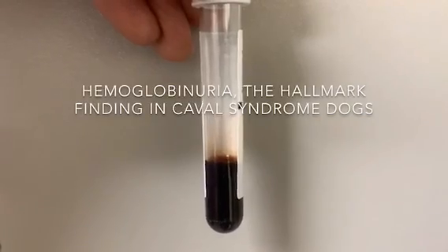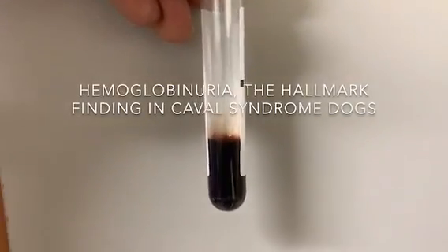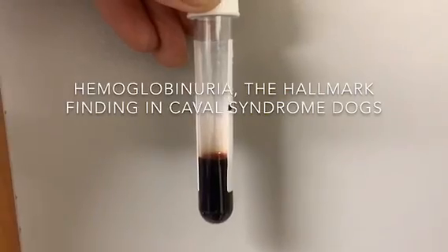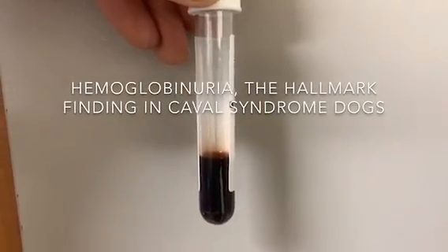Here is Cheyenne's urine after 15 minutes in the centrifuge. As you can see, there was no separation of the red cells, and so this is a true indication of hemoglobinuria.